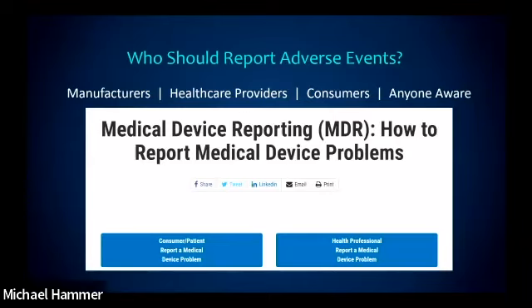You'll have similar opportunities in your countries. It's really easy to do. I see people in the room where I'll get a phone call of like, this occurred in my clinic, this occurred in my patient's home. What should I do? File a report, medical device report.